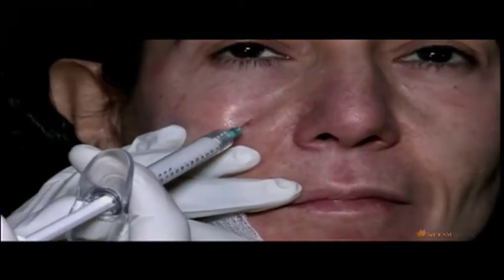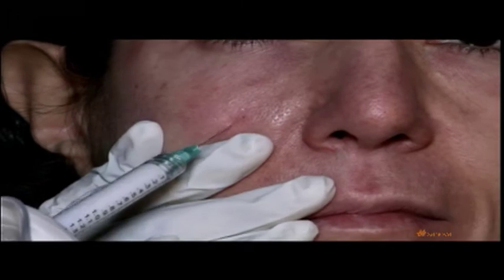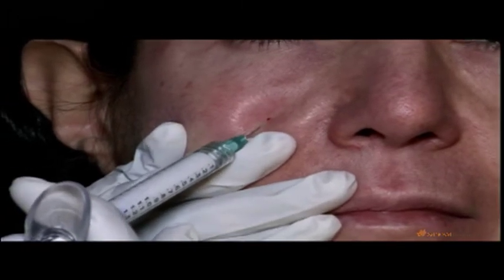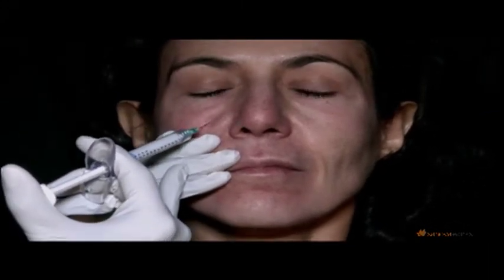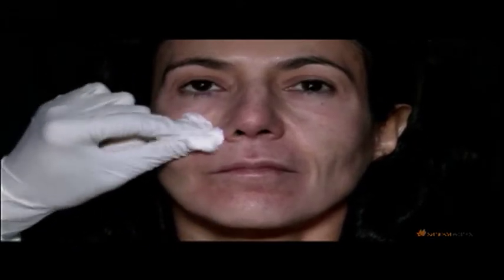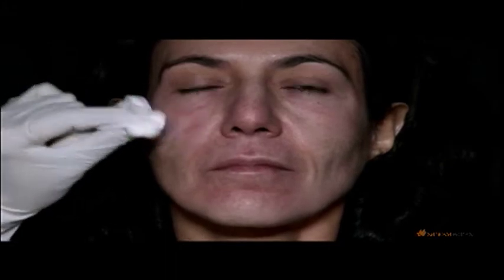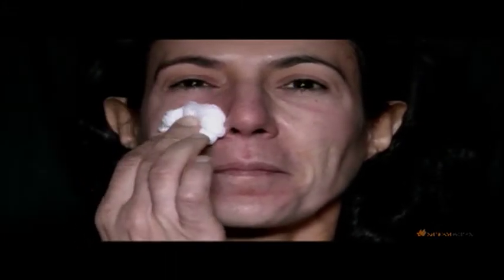And I can just move along here and volumize the medial mid-face. And you'll see these are very small microaliquots, and so far I've put in 0.2 of a cc. This is 0.3, and the amazing thing is you can already start to see an improvement. So this is the power of using a filler that has a high G prime that is volume efficient for lifting, because we don't have to use much of a volume in order to get an effect for Katya. Just hold here for a second, please, Katya. I'm going to change this needle.